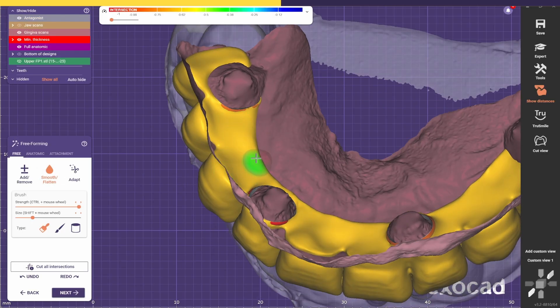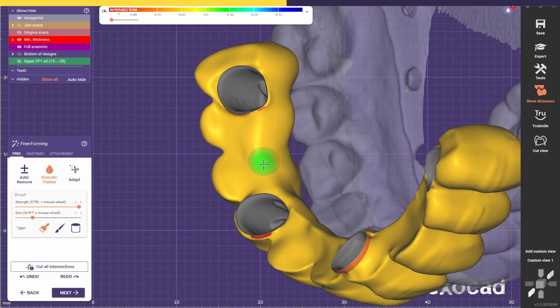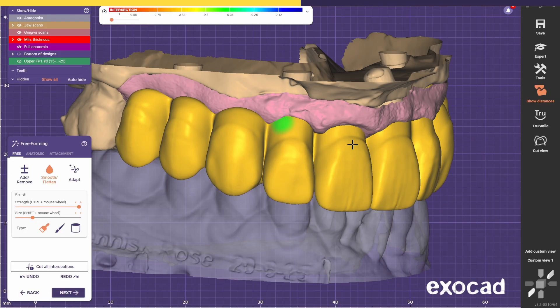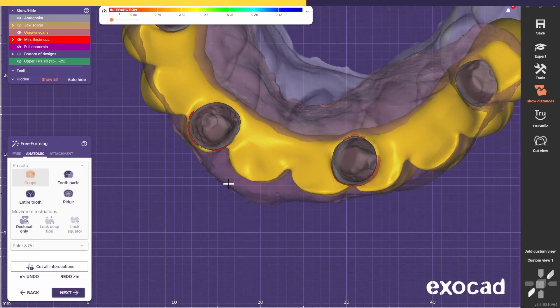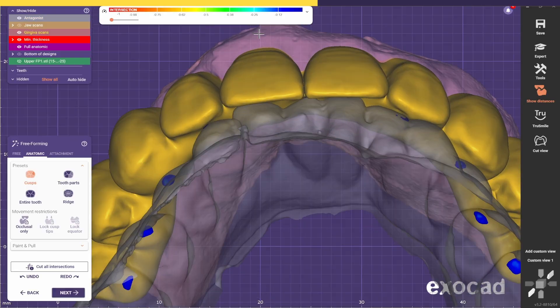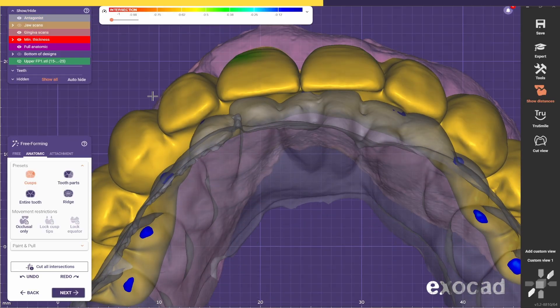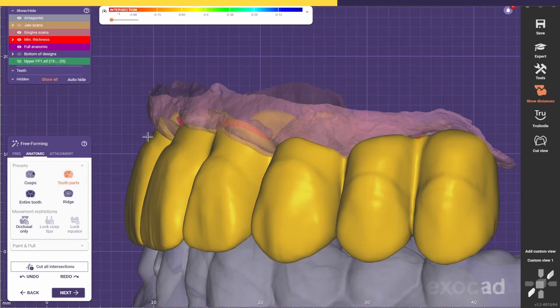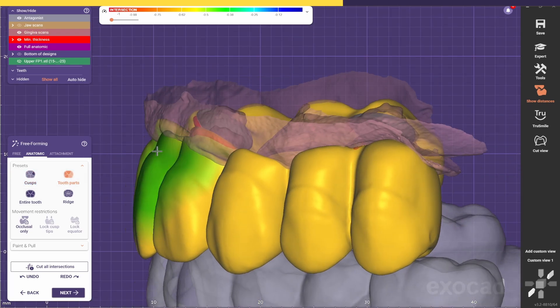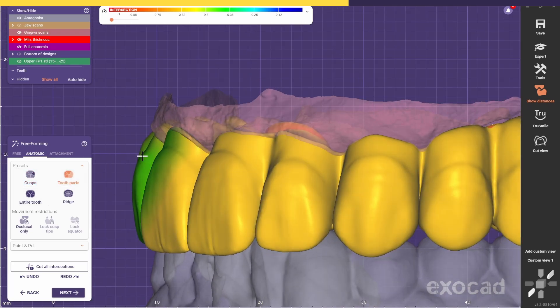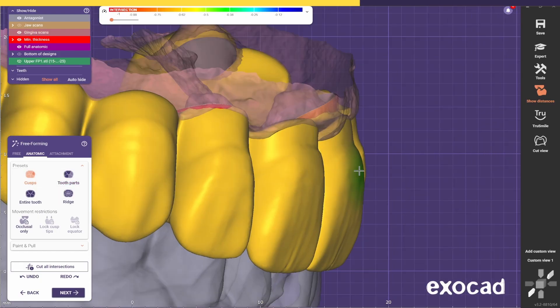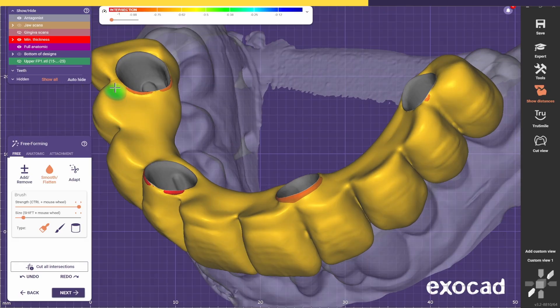Now I'm just going to smooth the areas and smooth the palatal. I'm going to try to bring this canine a bit more out, because since I pulled this one out I should bring this one out as well, just to be in the same buccal corridor. This one a bit more inside.